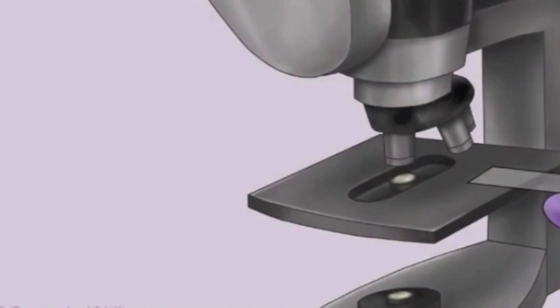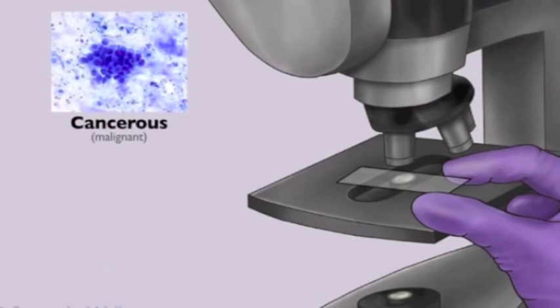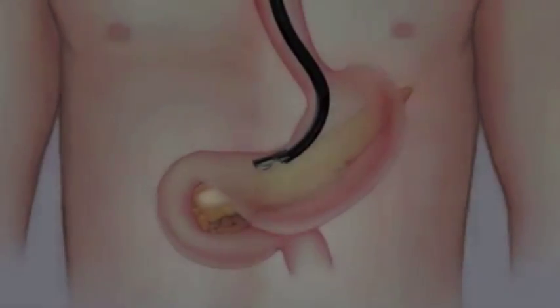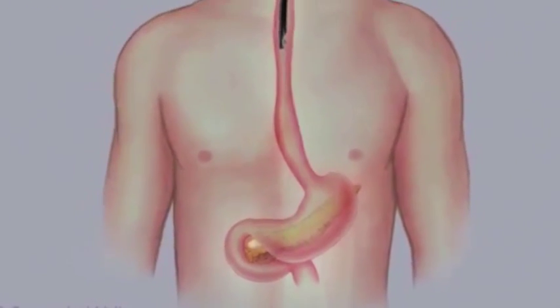The tissue sample is examined by a pathologist to determine whether the tissue is cancerous or non-cancerous. Some centers, including Johns Hopkins, can examine the tissue during the EUS procedure to confirm that enough tissue has been obtained for a diagnosis. EUS-FNA takes about 1 hour, and patients can return home an hour or two later.